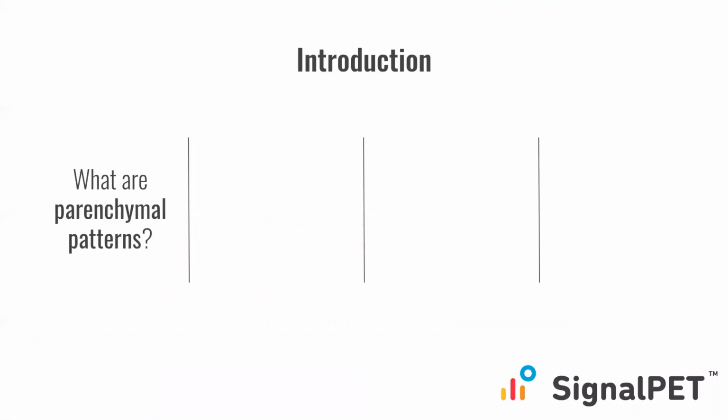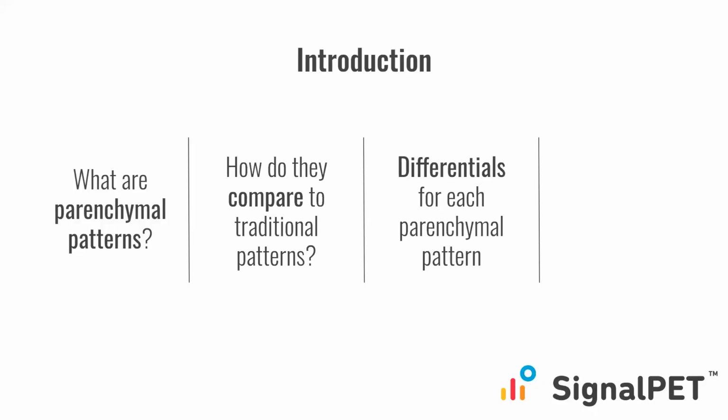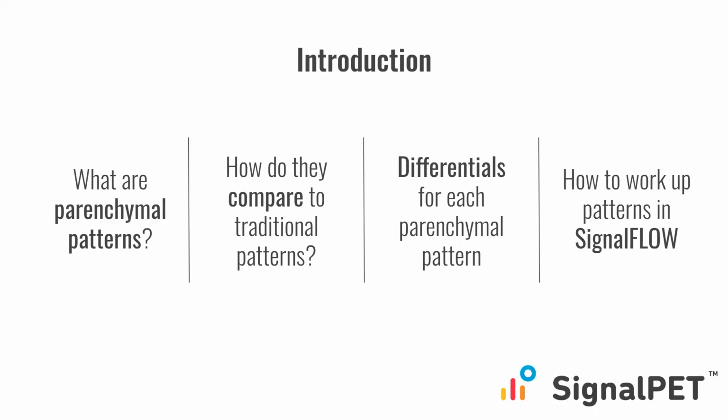In today's brief webinar, I will cover what parenchymal patterns are and how they compare with traditional pulmonary patterns. I'll review differentials for each parenchymal pattern, and then we'll also look at some examples for each pattern. And then I will demonstrate how to work up a parenchymal pattern in SignalFlow. Just a quick reminder too, there is a question and answer feature, so feel free to ask any questions. However, I will address the questions at the end of the webinar.